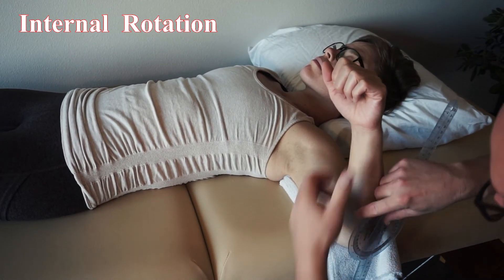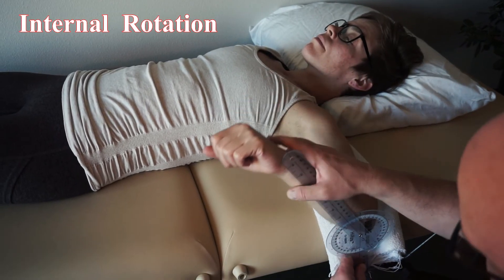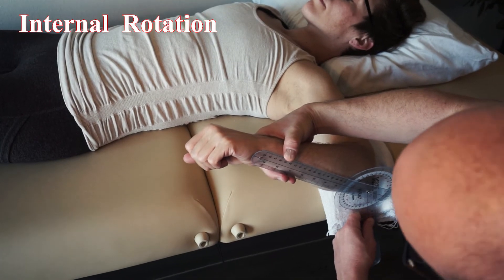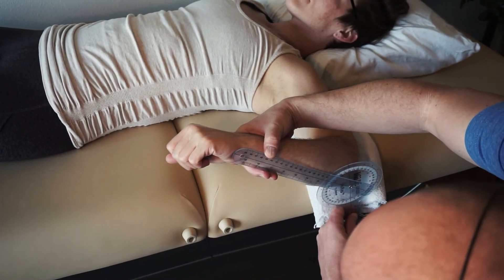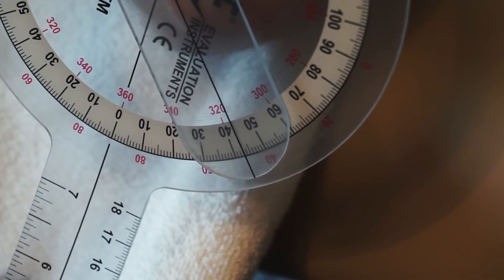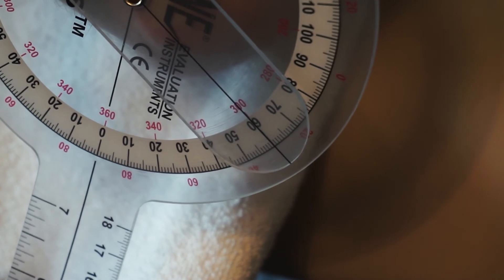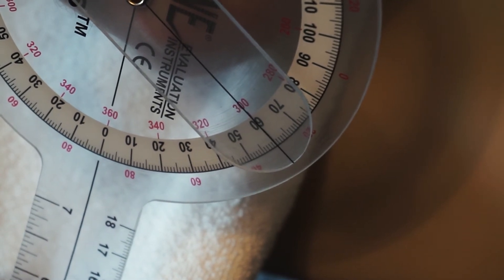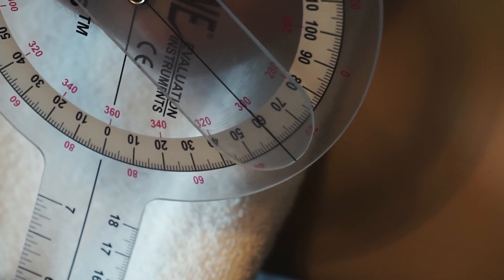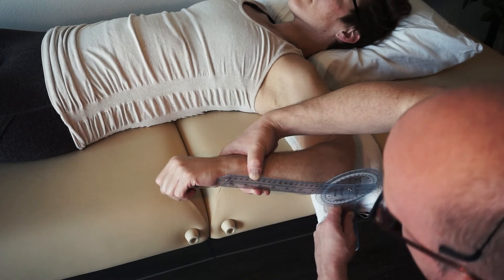Line those back up and then go ahead and internally rotate for me. She is at 45 degrees of active internal rotation. I'm going to push and I'm actually more watching her shoulder. And she is 61 degrees passively.